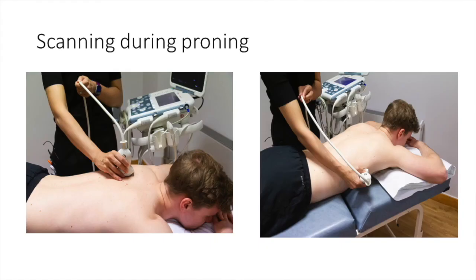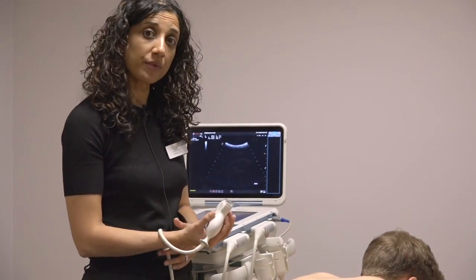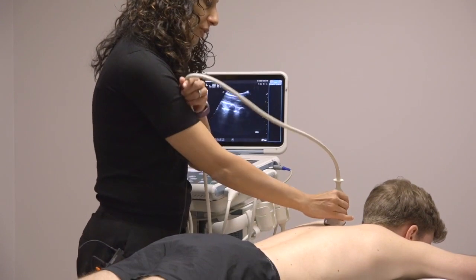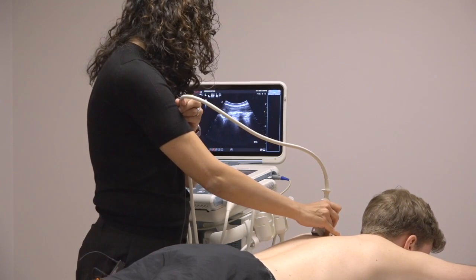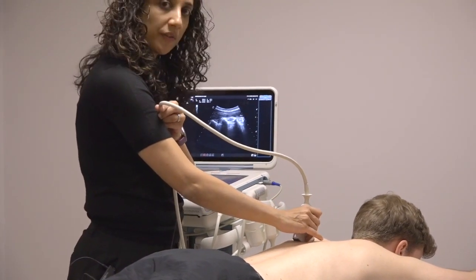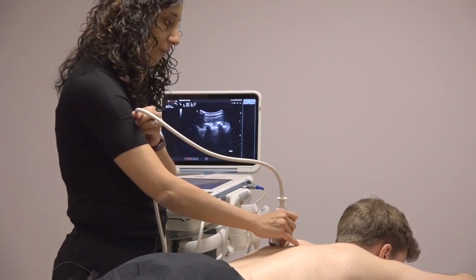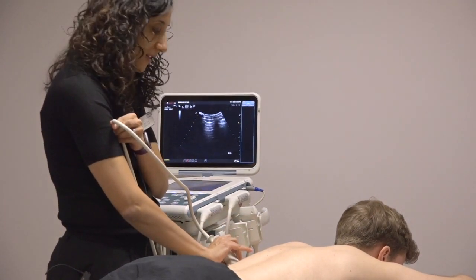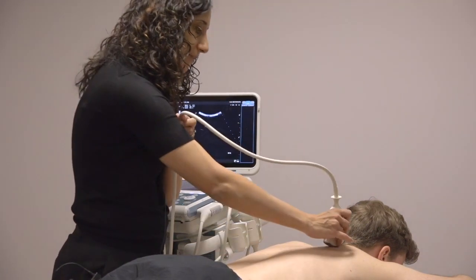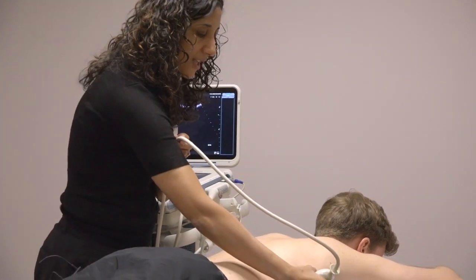Also in COVID-19, we are awake proning our patients, and if we need to scan, it's fine, we can do that whilst they're being proned. We would just do this in the posterior fashion, like so, and again in the lawnmower approach, scanning downwards, looking for the pathology that we'll be describing later, including B-lines, confluent B-lines and consolidation. And then you can move into the axilla, again looking for pathology. And the same on the other side, moving downwards and down round into the axilla.